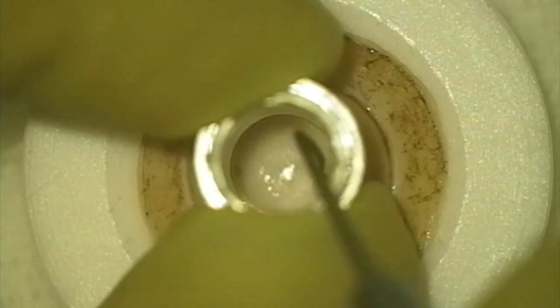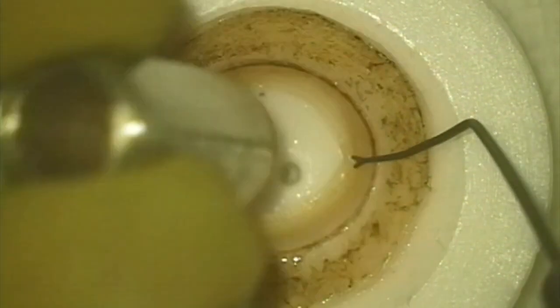This is a special double-bladed trephine for which I have a patent pending. You can see it has two concentric blades, one within the other, and these are available in different diameters. We generally use two standard diameters, and you can see me placing the trephine over the donor corneal scleral rim center and then making sure that both blades have cut through the tissue.